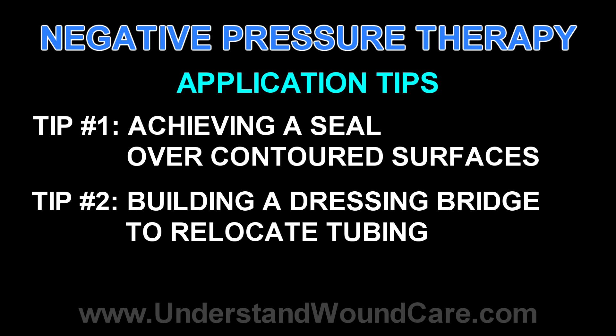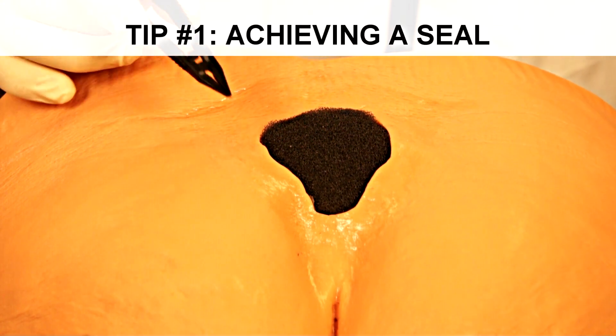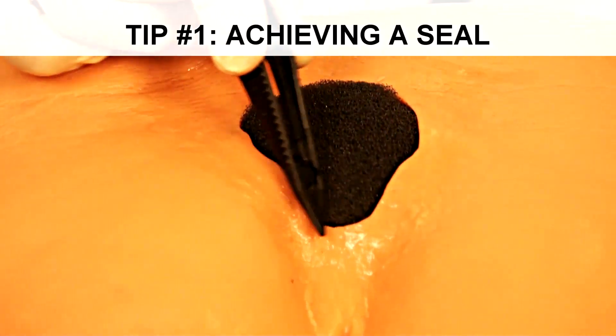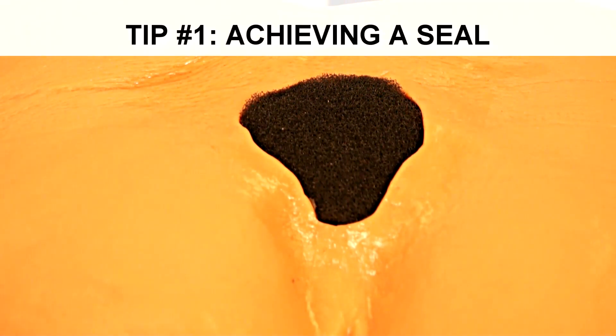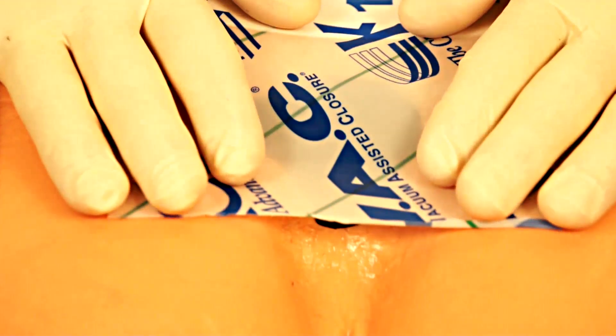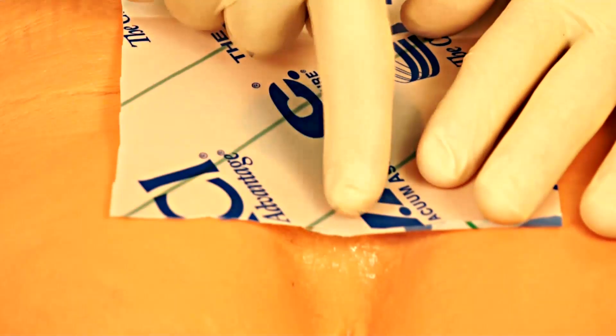One common problem that may occur when applying a negative pressure dressing is it may be difficult to achieve a seal around a specific wound. Commonly, pressure ulcers develop in locations of the body where the skin surface area is varied in its texture and depth. This is a sacral wound where you can see that within the cleft of the buttock there is a relative deficit. When applying the adhesive laid flat, you would see that there is a large defect, and getting the adhesive to stick and seal can sometimes be difficult.